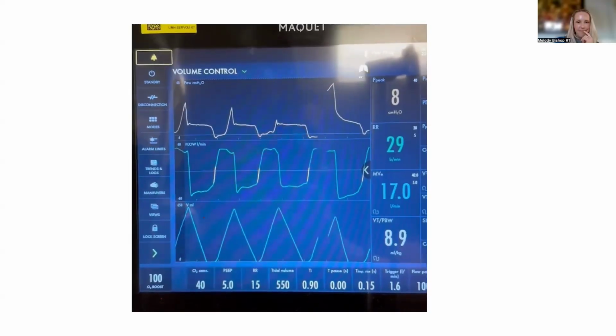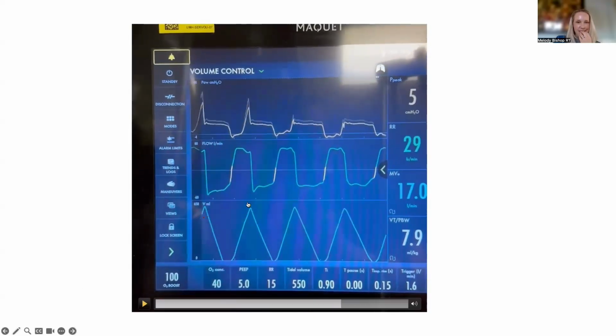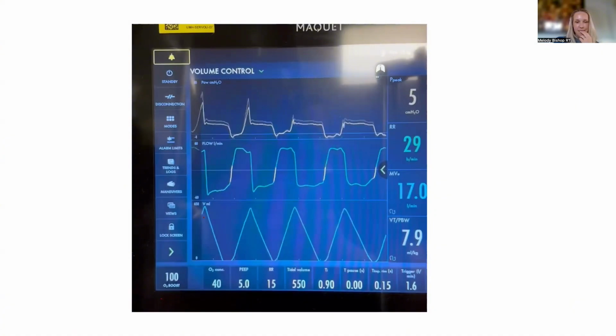Holy Toledo, this thing is terrifying, huh, Melody? It is just awful. As an aside, I don't know if you saw, but one of these days, I can't remember when, I asked, can the peak airway pressure be lower than the plateau pressure in volume control? Yes, no, maybe so. And I think I've got sort of a smattering of answers. So this should prove to you that, and right now the peak is 5, right? So certainly the plateau pressure is definitely higher than 5. So your peak airway pressure in volume control can certainly be lower than the plateau if you have a patient that is this active on the vent, right? It should be lower, right? Sort of by physics, but if the patient's very active, it might not be lower.